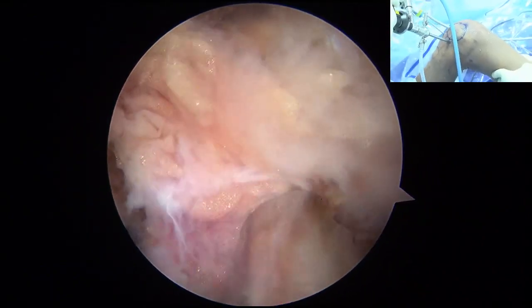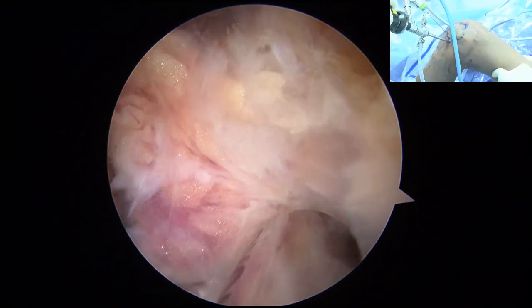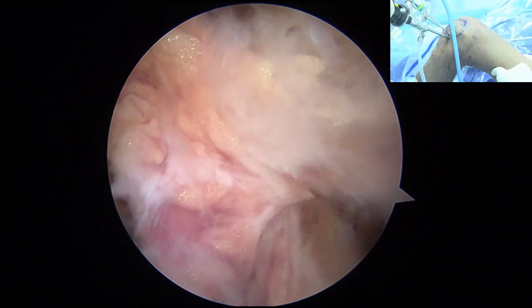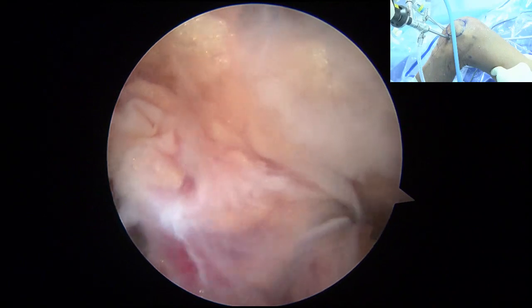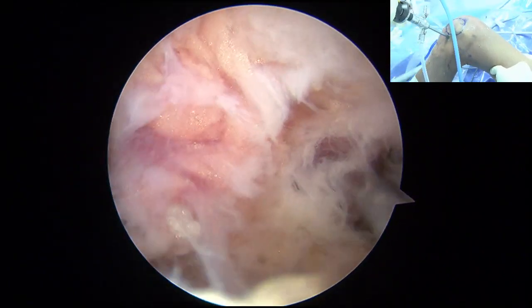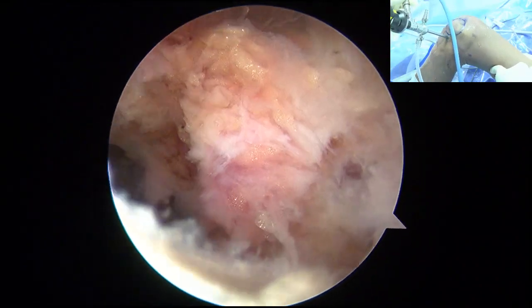So this area, then you see the holes there, okay? Because it's the posterolateral window, okay? You see that? That is the posterolateral window now, okay? Okay, good. So that is the posterolateral window, you see that? That is the posterolateral window, okay?